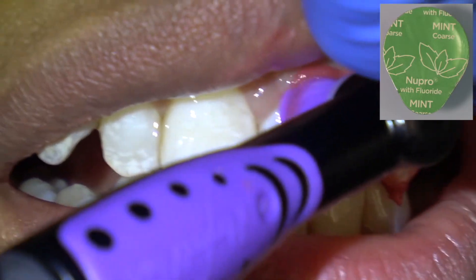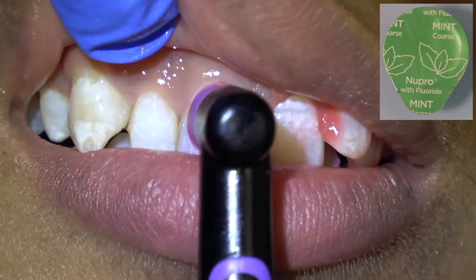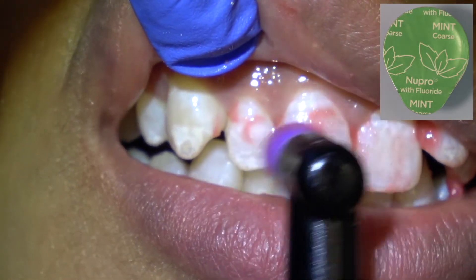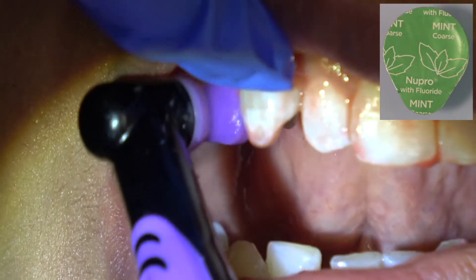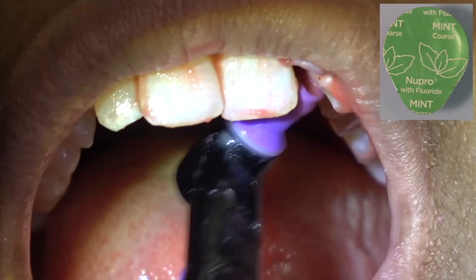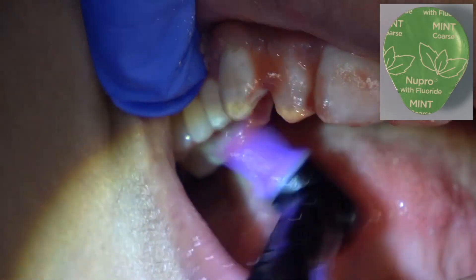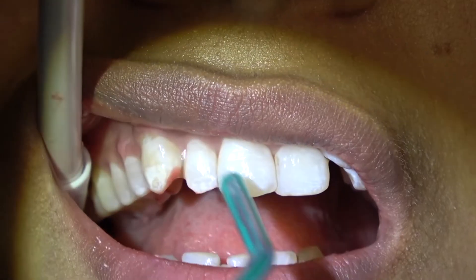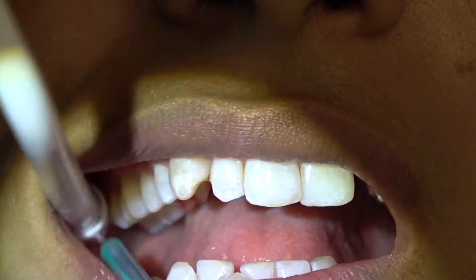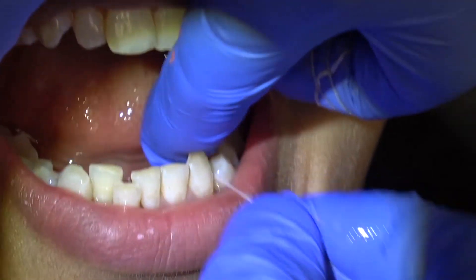This is just a week later, and already there's not much bleeding. If the patient doesn't execute proper home care, the calculus, plaque, and stain are going to form on the teeth again and they'll be right back in the same boat within several weeks or a month. When I'm getting my teeth cleaned, I like to hold the slow-speed suction myself so that whenever I need to suction out, I can — and that's something your patients might like to do.